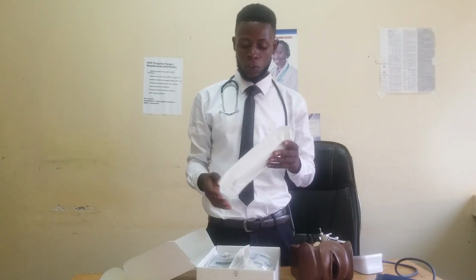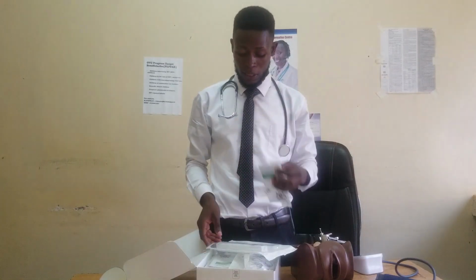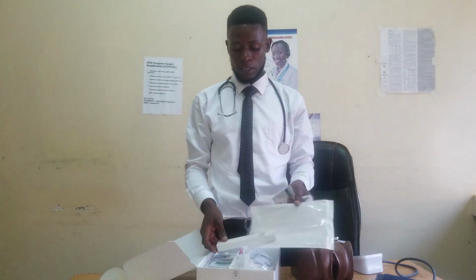It comes with distilled water or sterile water, so you wet it. This is how it comes. You open it. It comes with these 2 swabs. It comes with a guide. Everything that I open will have a guide here. It has 3 seals. Then it has distilled water. So these are the ones that come with the fingernail swab.